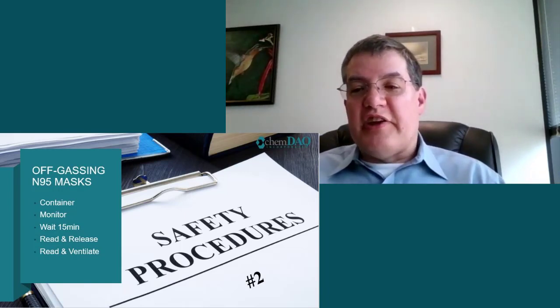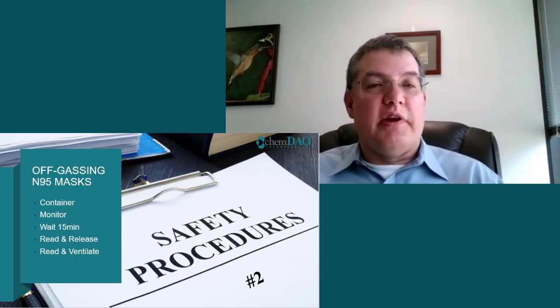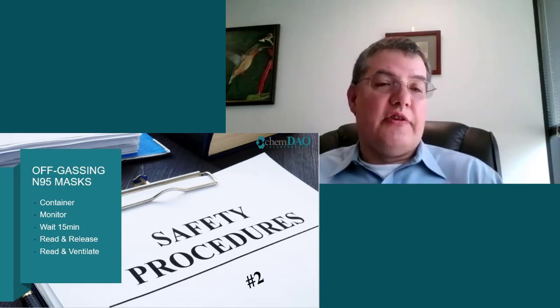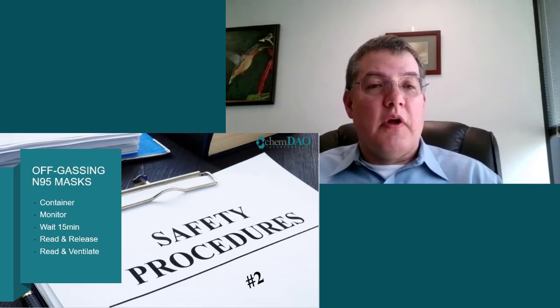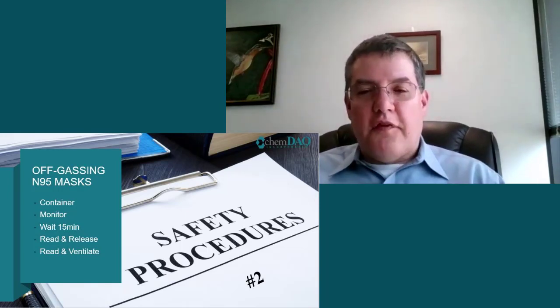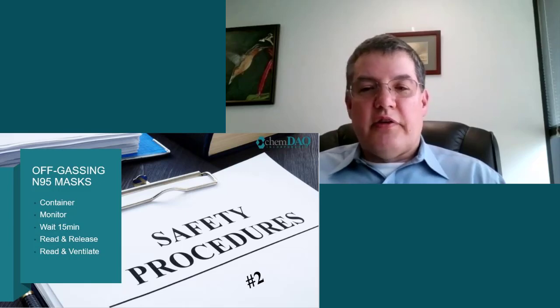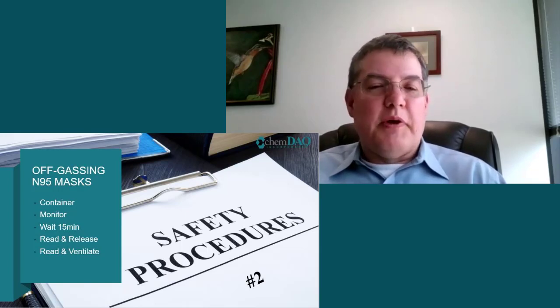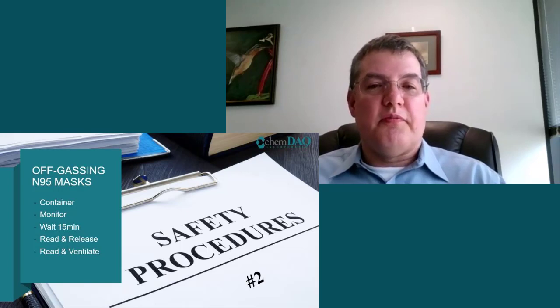The material is then said to be outgassing hydrogen peroxide, or whatever the sterilant gas being used is. We see outgassing with other types of sterilant gas too. Ethylene oxide, for example, is notorious for outgassing after sterilization. The rate of off-gassing depends on the materials used to make the mask, the gas used to disinfect it, and the conditions. The next person to use the mask has enough on their mind that they do not need to wonder if they are being exposed to hydrogen peroxide. So yes, the mask should be given enough time to off-gas the hydrogen peroxide before it is returned to service.